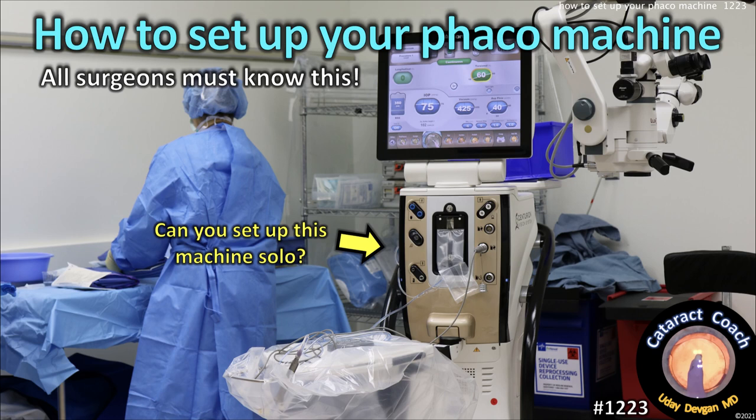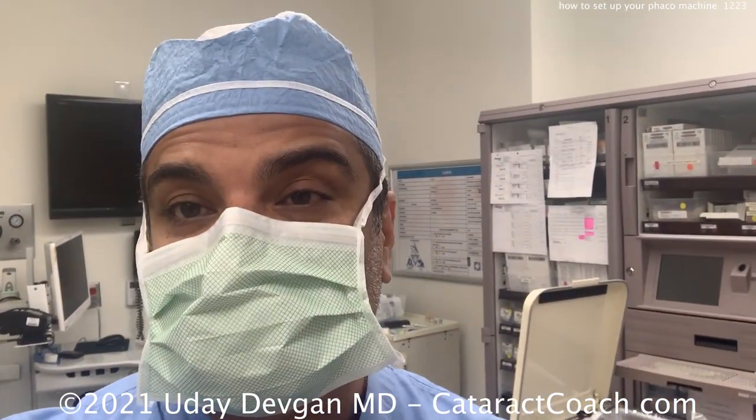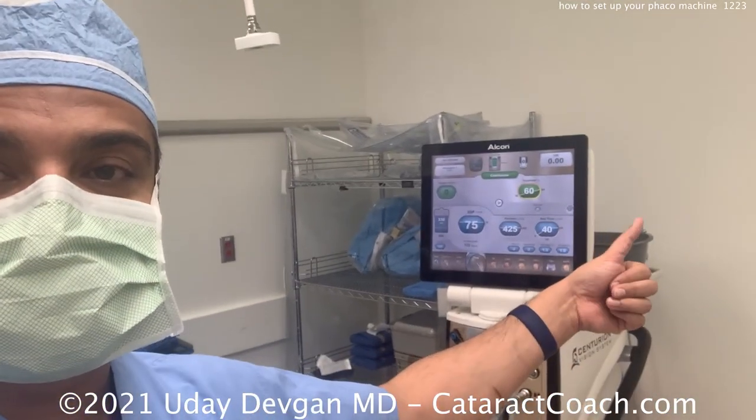CataractCoach.com. How to set up your phaco machine — all surgeons must know this. You've got to be able to do this solo. I know you're the big surgeon, but you also have to know how to set up the machine. What if you have a tech who's not capable of doing it? What if you're here in an evening for a ruptured globe case and want to take the lens out or evacuate a big hyphema? You have to know how to set up that machine. So let's show you a video of how to do so.